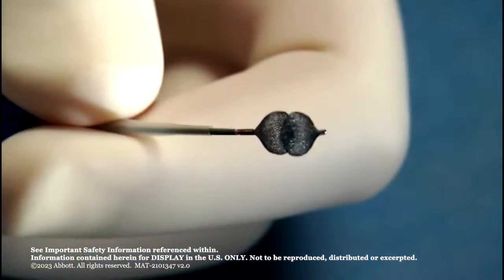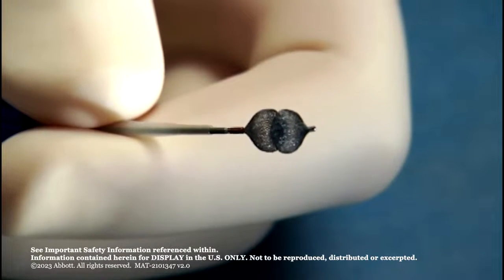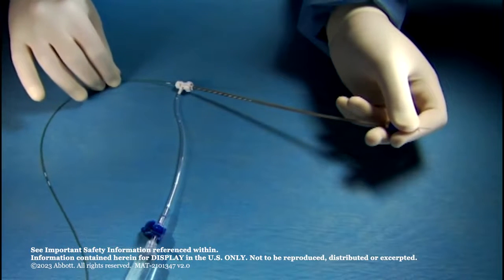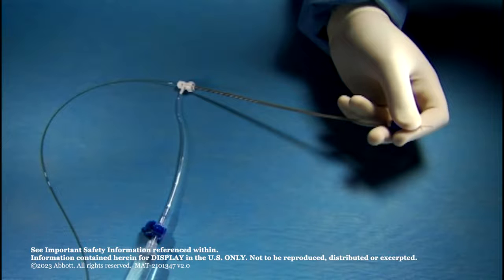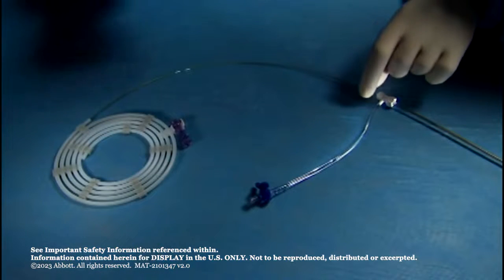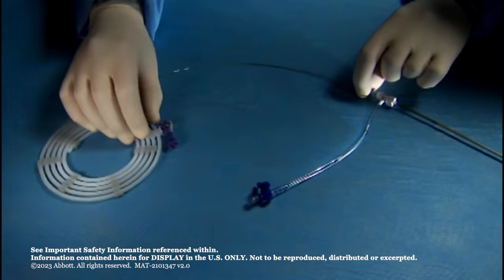If the device is accidentally deployed, grasp the spring-loaded tapered loader tubing and the rotating lure in one hand and retract the delivery wire with the other hand. Continue to retract the delivery wire until both the single white marker and the double white marker on the delivery wire are visible. Re-flush the device if necessary. Remove the loader and the delivery wire from the hoop dispenser.